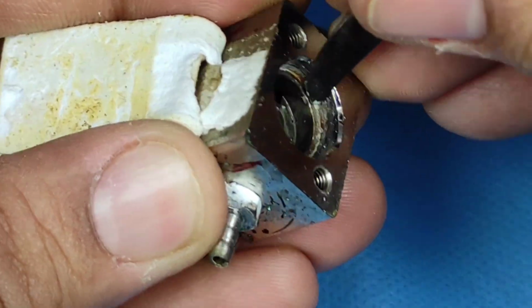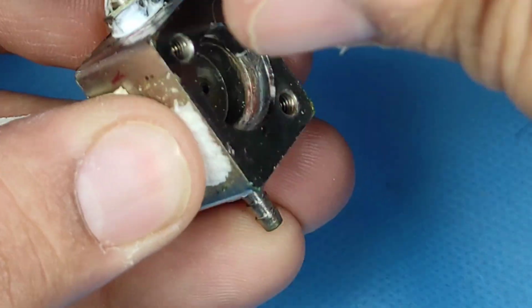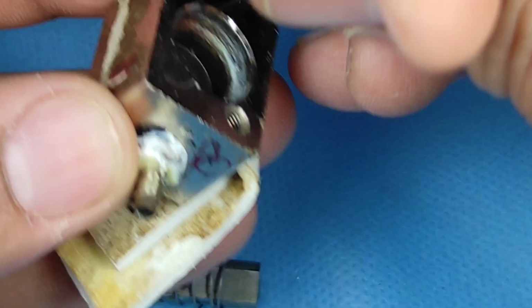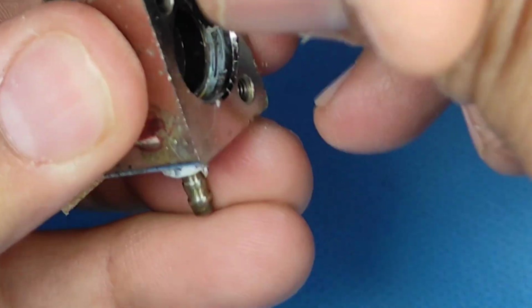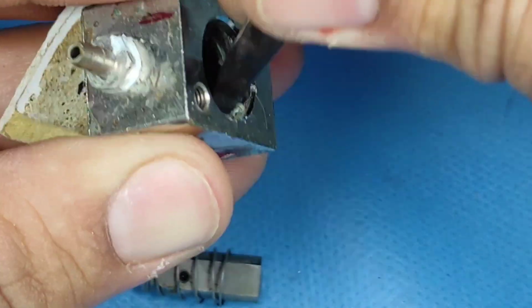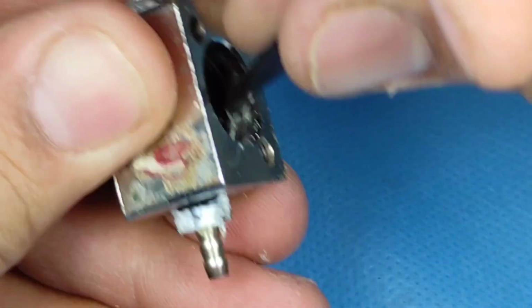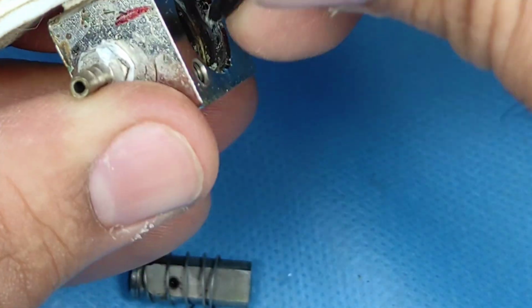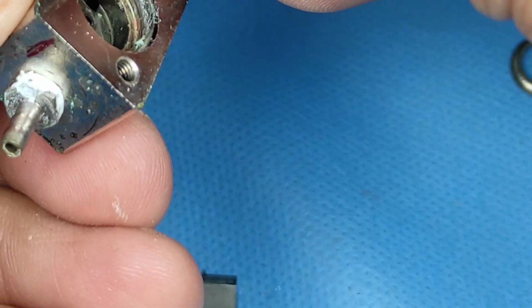These are a partial reason for it, but the scales will be deposited on the piston, and it will affect the magnetic current to raise the piston up, and that is the main reason for it. Okay, but still, since we have opened it up, better to clean as many scales as possible. These scales are like our dental tartar and plaque. When they start with a very small quantity and suddenly increase. Okay, so you don't take them lightly and you clean as much as possible.